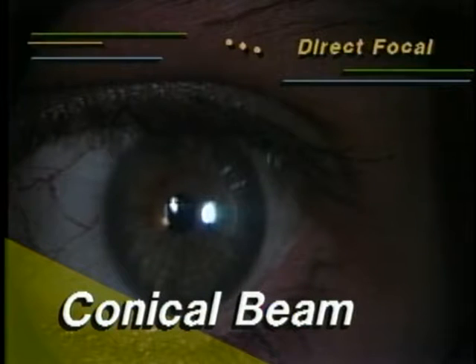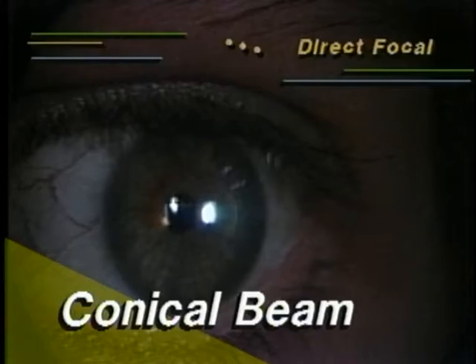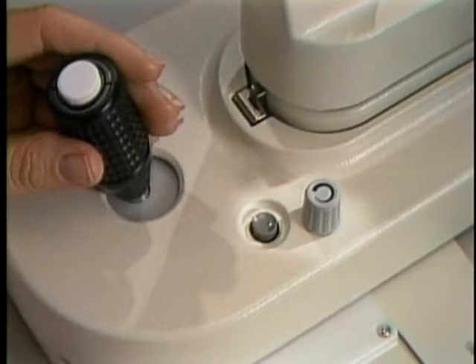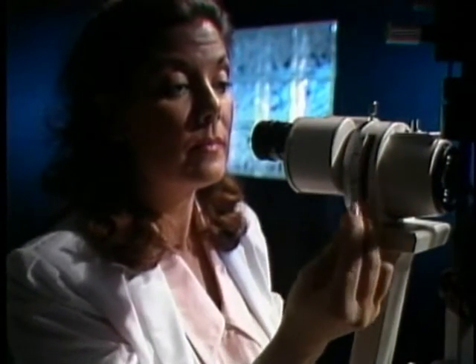A parallel piped transforms to a conical beam by decreasing the slit height to a small spot. The angle between the light source and microscope is about 45 degrees. The rheostat intensity is set on high, the room light dimmed, and magnification set high. A conical beam is used to detect the presence of cells and flare in the anterior chamber. Decrease the slit height to fit within the pupil. The two reflections are from the cornea and the front surface of the lens. Begin by focusing the beam on the cornea, move the joystick forward to focus on the lens, then move the joystick back half that distance to the midpoint of the anterior chamber. This is the area to view for cells and flare. There are no clinical signs present in this healthy eye.